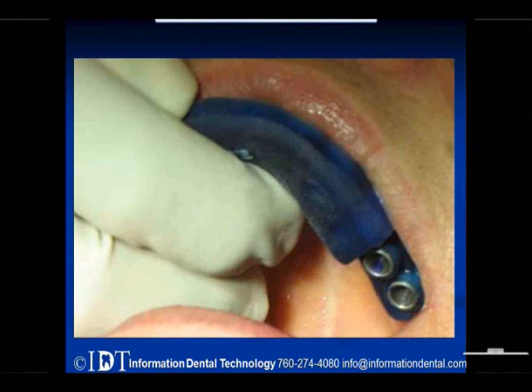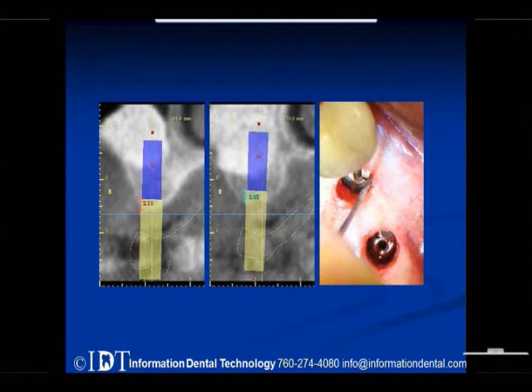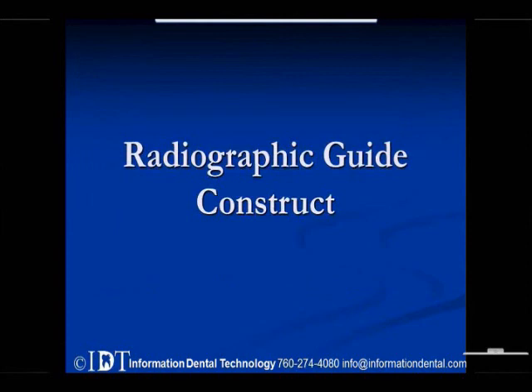The implants were placed using the surgical guide. And then, this one was done flapless. They did a tissue punch. I've seen it done a lot of different ways. I've seen them do a little window, or I've seen them drill straight through the soft tissue. So that's personal preference. That's the more common approach or technique.